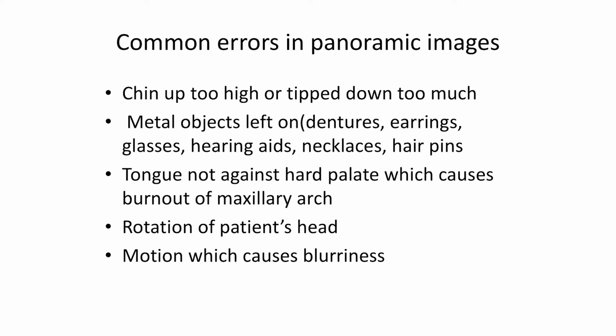Rotation of your patient's head, if you have it rotated left or right, and motion, which causes blurriness. If your patient swallows during the x-ray, or I've had patients start talking in the middle of the x-ray, then you just say stop, and we'll just restart it again. Or if they have tremors or muscle spasms, you just do your best with that.